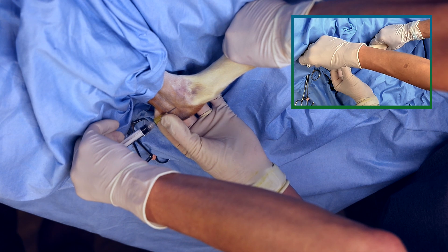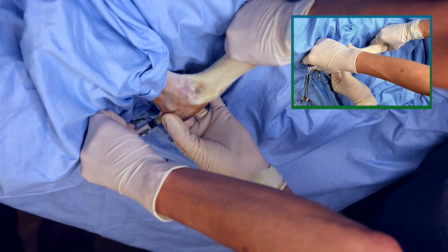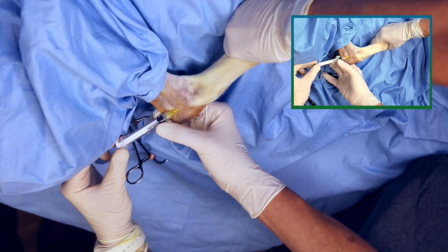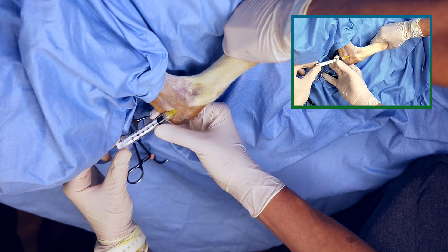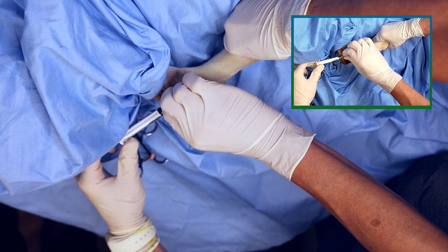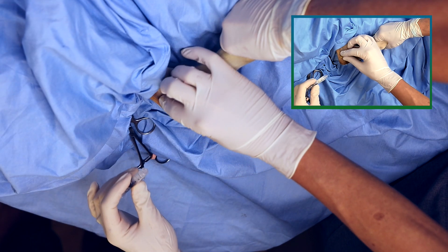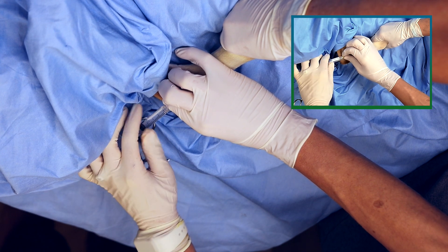Advance the needle into the joint. Rotate the needle to clear the bevel and observe for joint fluid. In this example, the syringe was used to advance the needle into the joint. If there is no joint fluid present immediately, aspirate with a syringe — you may not get much fluid from this particular joint. Make sure to use a luer lock syringe to prevent losing the connection to the needle during the injection.